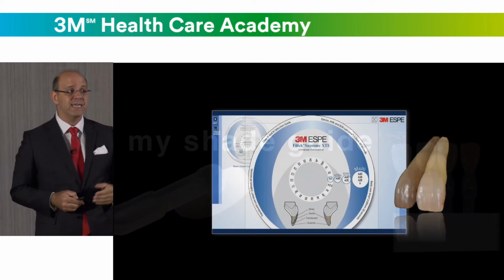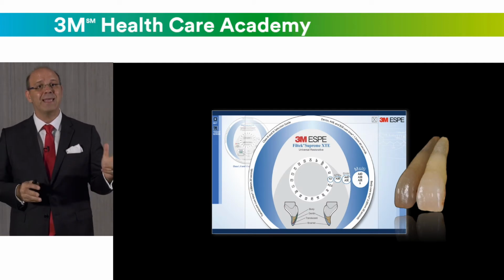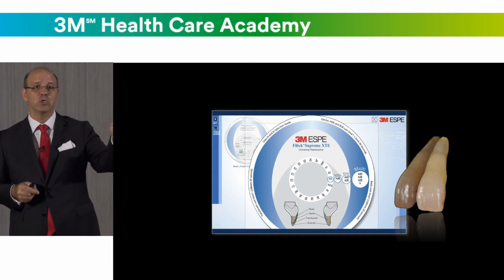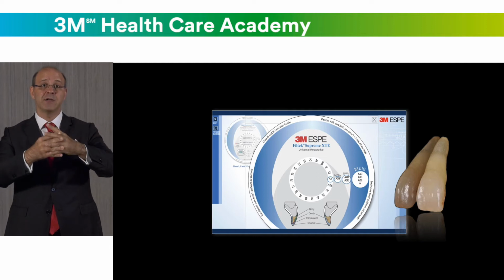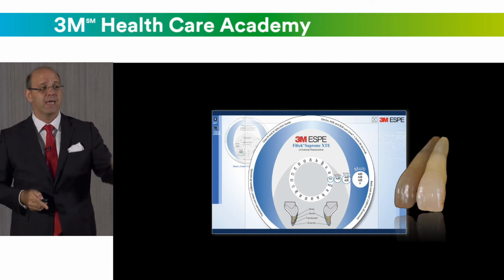Another way is that some manufacturers have a kind of recipe, based on the Vita shade we want to get, where you can choose what different opacities and shades I have to put together to end up with that Vita shade.